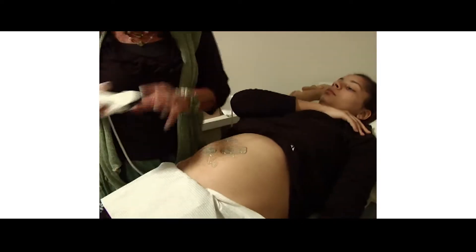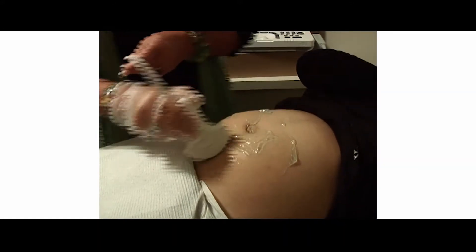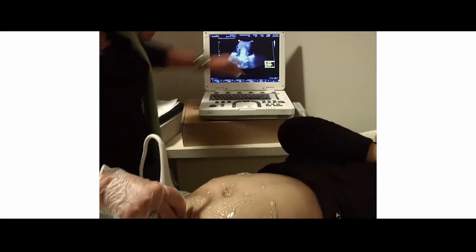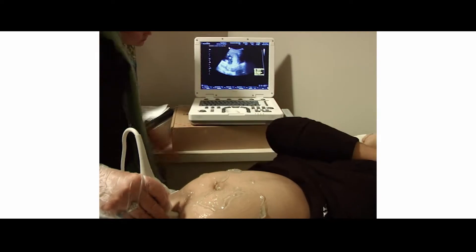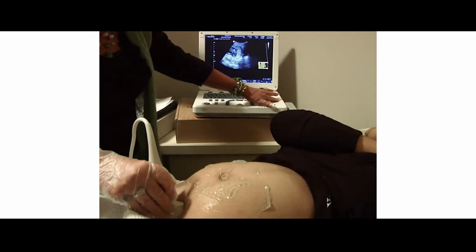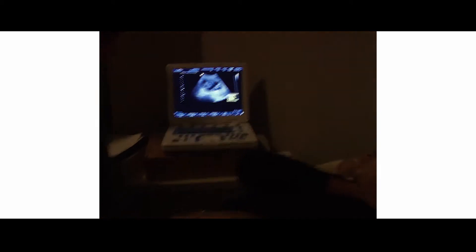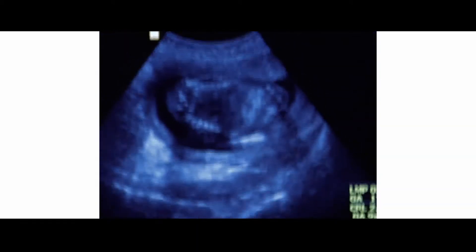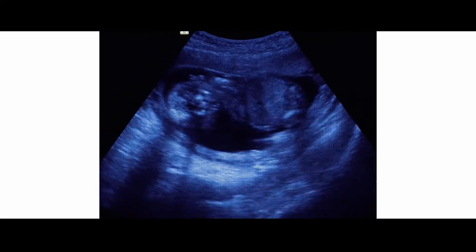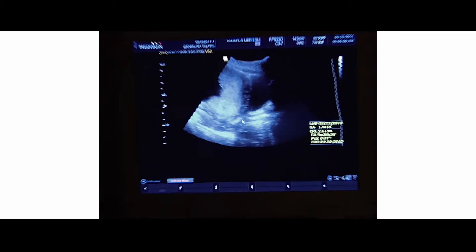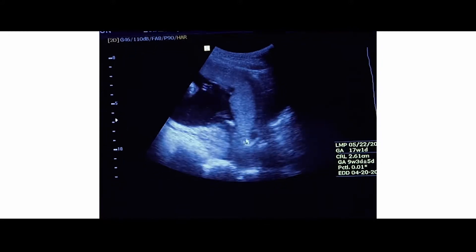The first thing you're going to do — you've got this little knob right here, you always want that pointing up toward mom when you're in the sagittal plane. Go ahead and put the gel on. Your first picture is going to be down low — you want to get one of the bladder and the vaginal canal. It's a little bit bright so we're going to bring down our gain; the focal zone looks okay. We can see baby moving — let's say hi to baby first and see that heartbeat. There's the heartbeat, there's the head, little eyes.